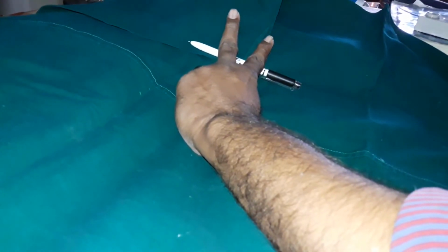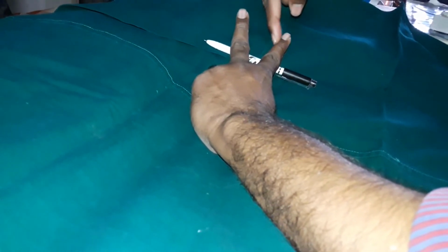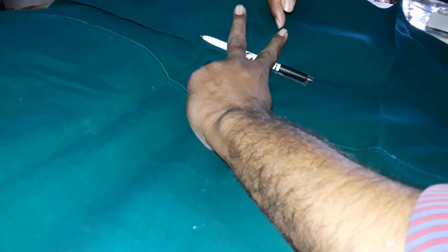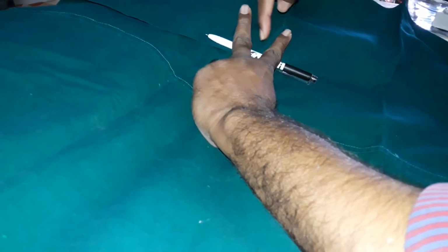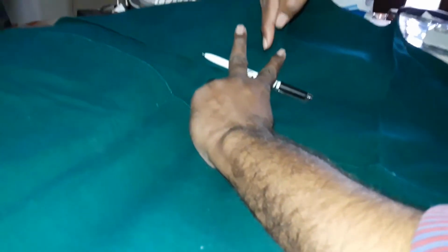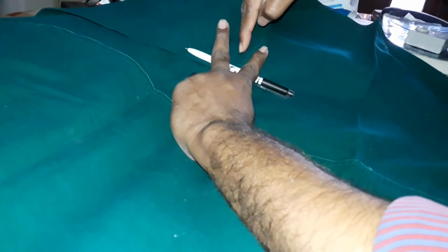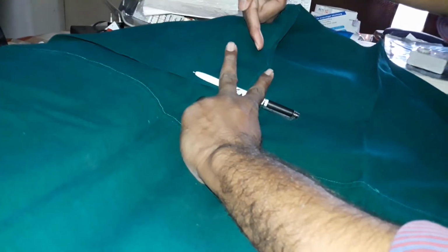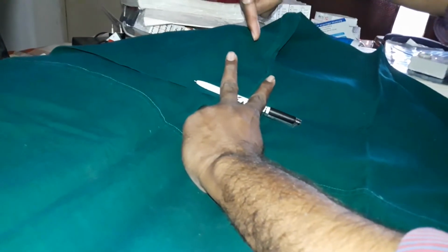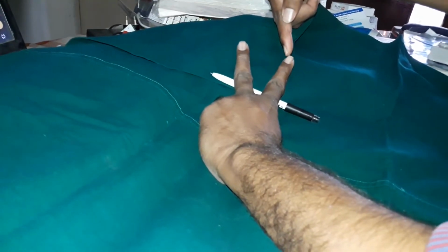From this side, this is the short process of the incus, and this is the vertical part of the facial nerve. In this area, once you identify the short process of the incus, here you can drill. Initially you will appreciate the mucosa, and you just follow that mucosa, you will appreciate the cell. All you need to do is just dilate that cell. That's it. And this pointer, the short process of the incus, exactly points to the second genu.